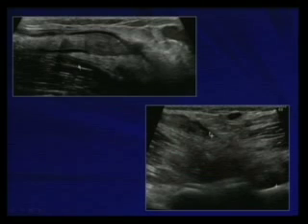We can see the brachialis in the sagittal view, and we see the tendon stump in the long axis view. Here, we are measuring the distance from the stump, that is here, to the bicipital tuberosity. So the surgeon can go there and reattach the tendon at the bicipital tuberosity.